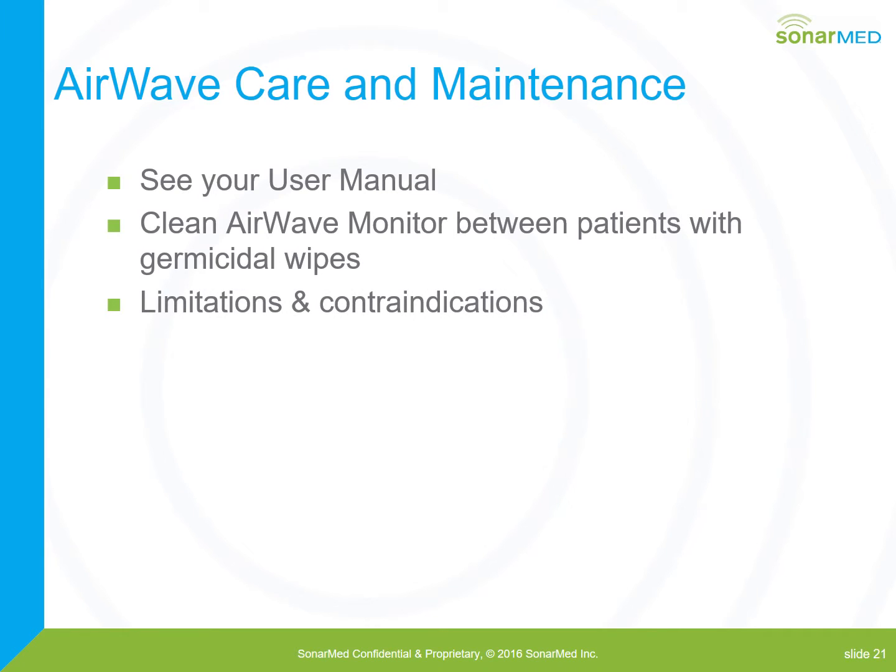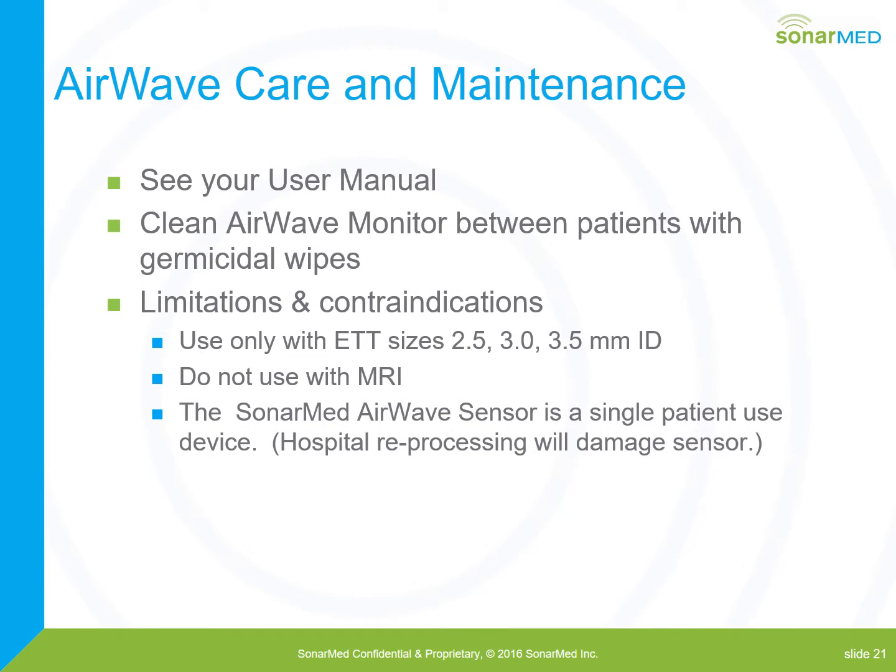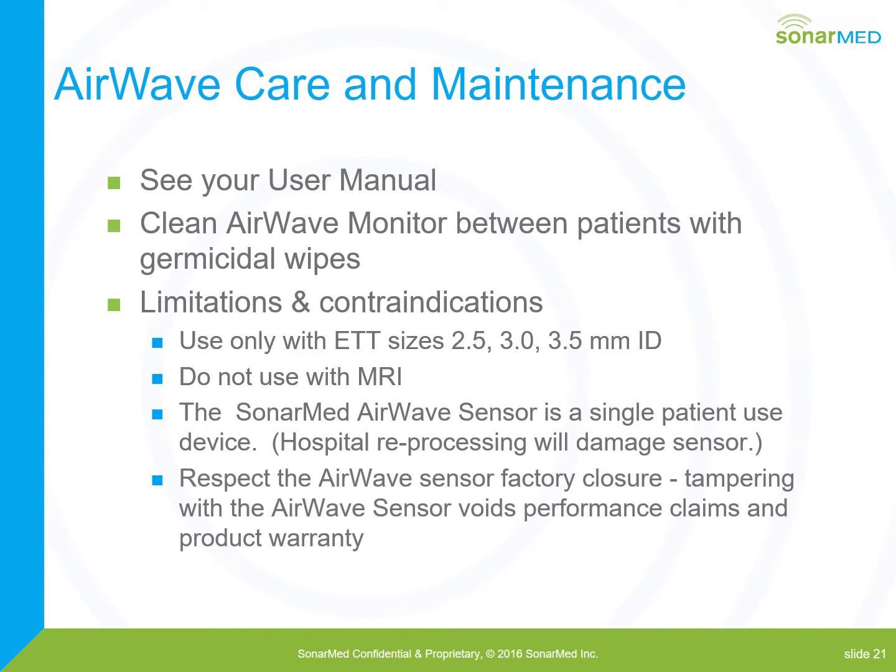You want to know your limits and contraindications. We're using it in the NICU with the 2.5, 3.0, and 3.5 millimeter ID. We talked in Module 2 about it not being compatible with MRI. Great as a transport tool to the MRI unit, but not inside the MRI. As I already said, it is a single patient use sensor. Reprocessing that sensor will damage it. Any kind of reprocessing will damage it, so you only want to use it on one patient.